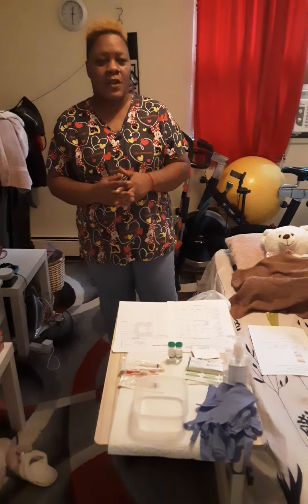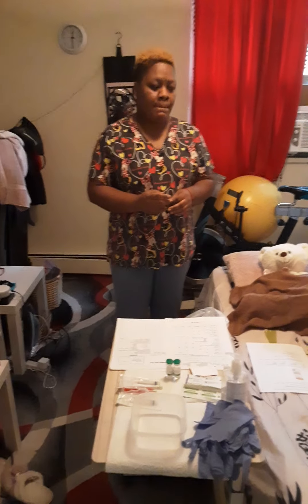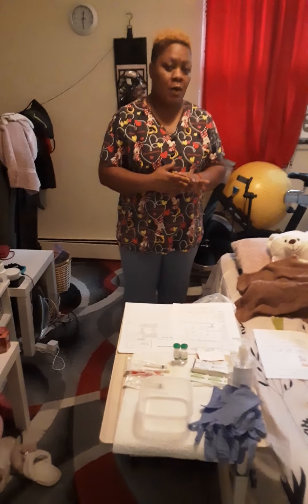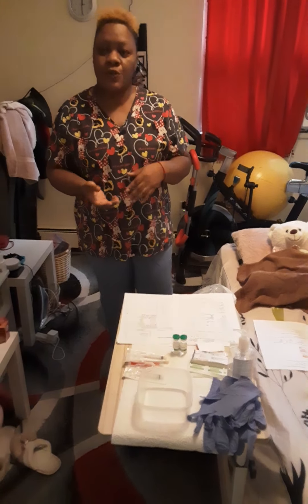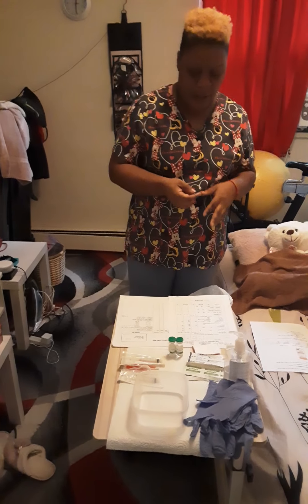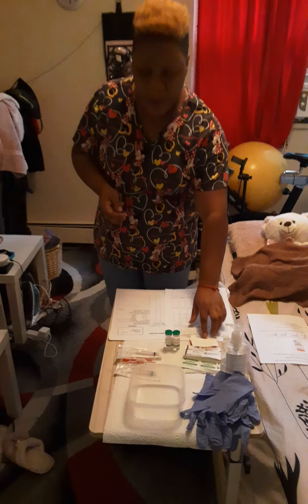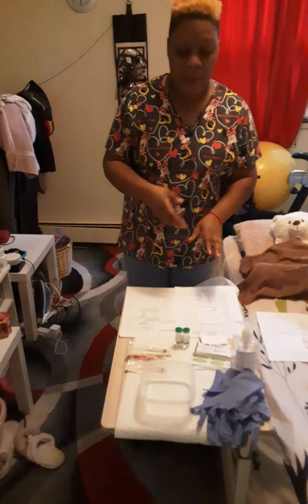Hi, my name is Melissa and today I will demonstrate how I go about mixing and administering medication to a patient intramuscularly. The first thing I'm going to do, I'm going to go into the room, I'll close the door behind me, and I would compare the information that I have on the doctor's order with my MAR.